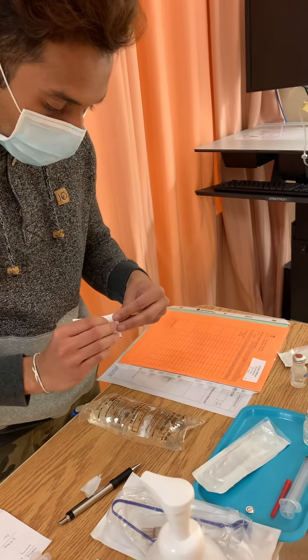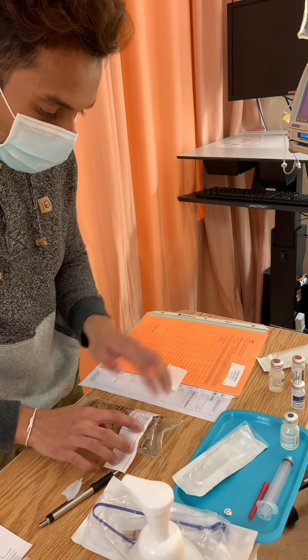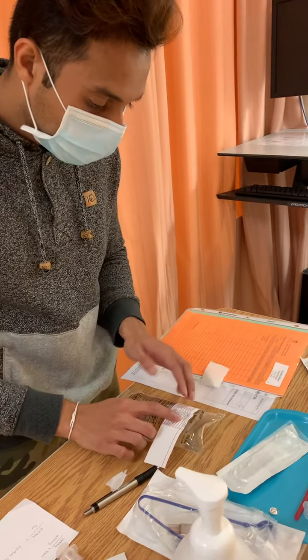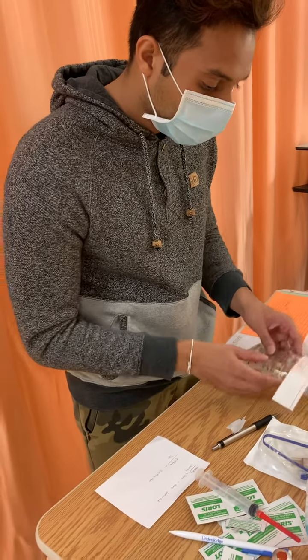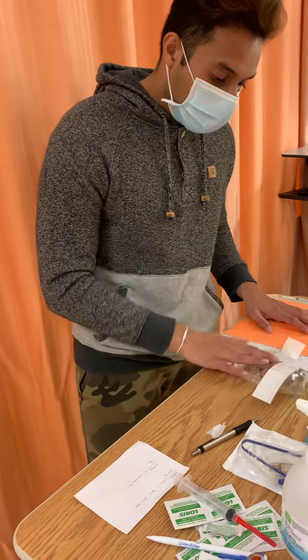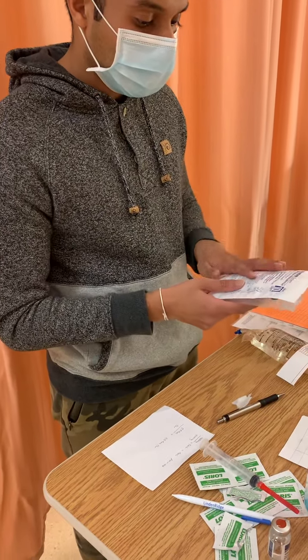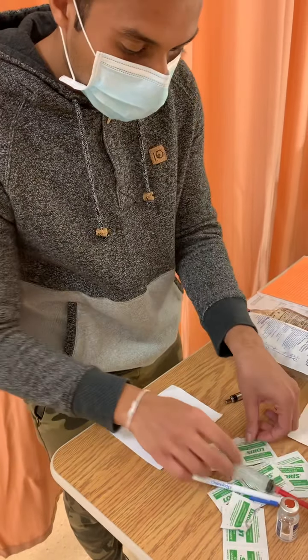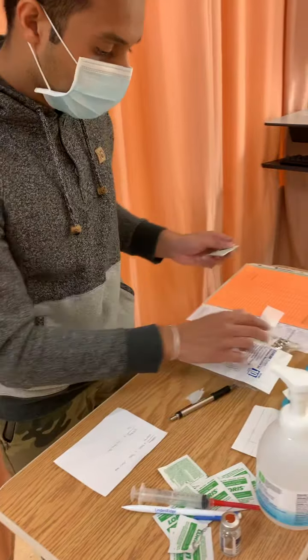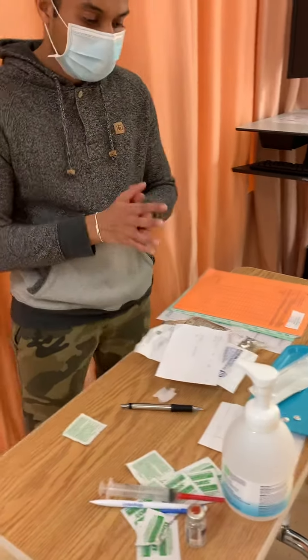And we're going to attach our med label onto this. And review our med label. So we have the patient name is Watson-William. The medication is Azithromycin. There's 400 milligrams in here, 4 mLs we injected in, giving a total of 254 ml in the mini bag. So that's good. And we're just getting our supplies now. So we have our secondary medication set. It's not expired or anything. It's all good. It's intact. And we're getting our alcohol swab, our calculations, and a pen or an RN. And we're gonna wash our hands and just head to the bedside.